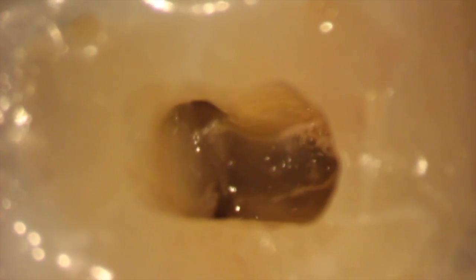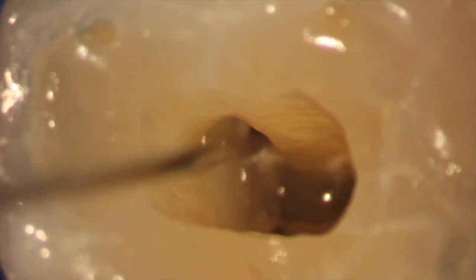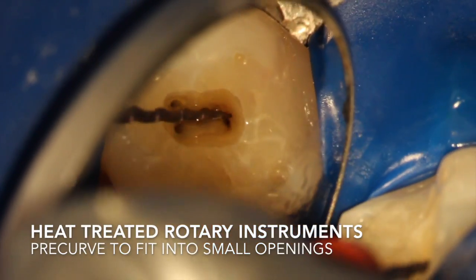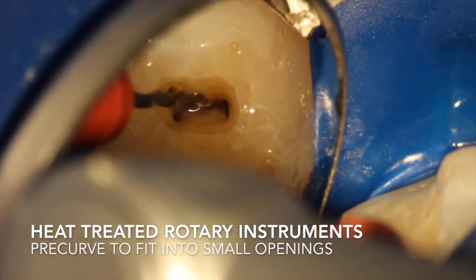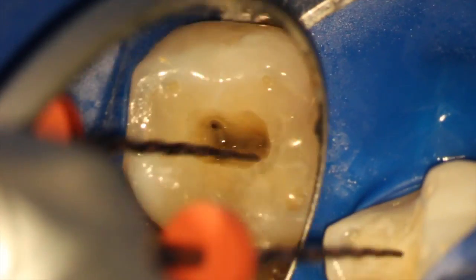You can see a very small access opening with nice, clean, smooth walls. A lot of rinsing with EDTA, and as I always do, heat-treated rotary instruments, pre-curved, so patients don't have to open so wide. You don't need them to stretch open so wide — we just pre-curve these little rotary instruments.